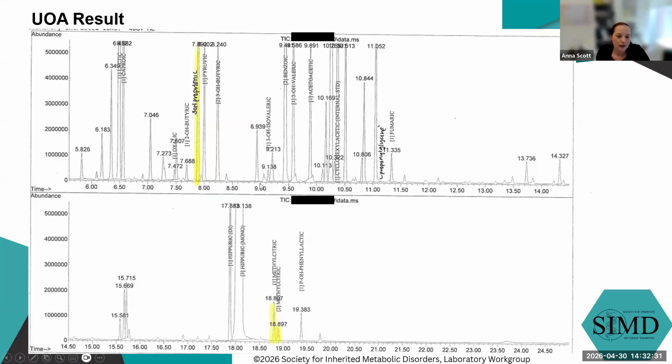Now, our methylmalonic excretion is this little peak down here just after 9 minutes on our instrument. So knowing nothing else, that is enough to say, high concern for propionic acidemia. I can't tell you if it's a type A or a type B, because note there are 2 genes that make up that carboxylase, but normal MMA excretion with significant methylcitric and 3-hydroxypropionic, we're worried about a propionic acidemia.